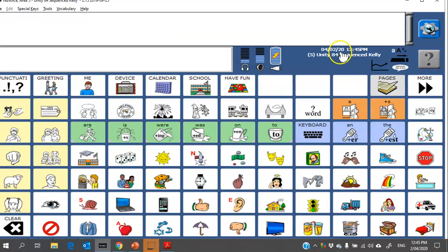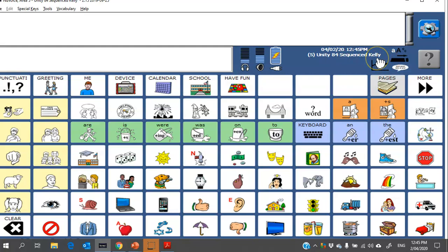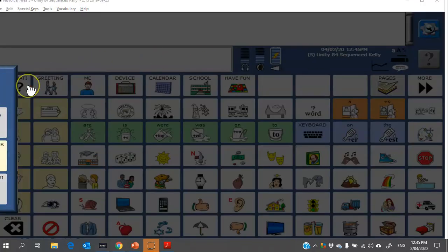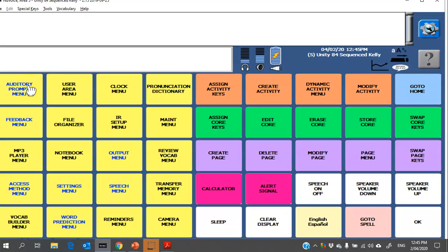All right, so I can see now that it's loaded Unity 84 Sequenced Kelly. Next step would be to think about your access method, how the person will be interacting with the device, and also choosing a voice. So that's under here: Toolbox and then yellow toolbox and I'm going to head into the access method menu.